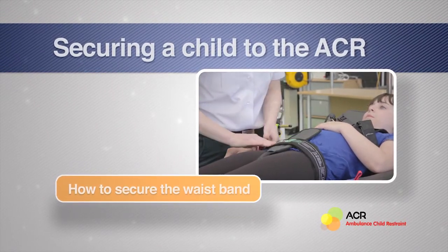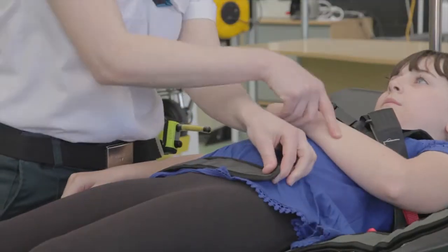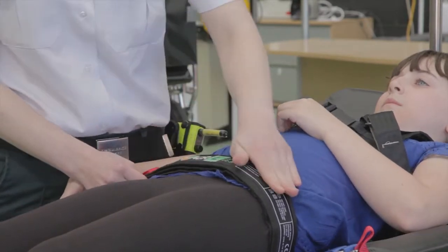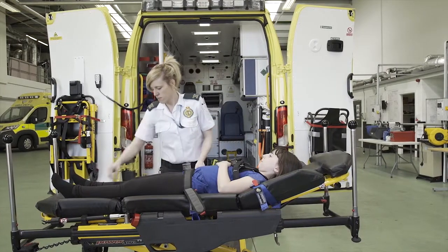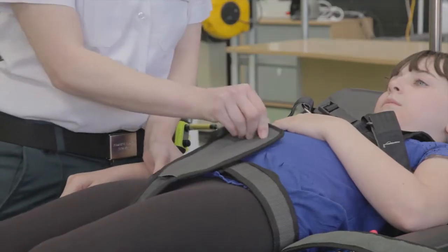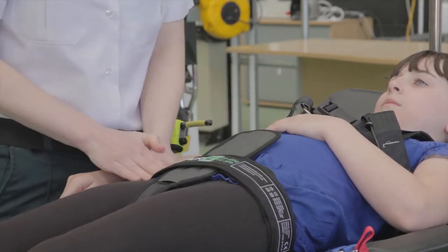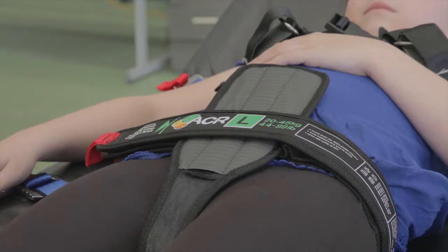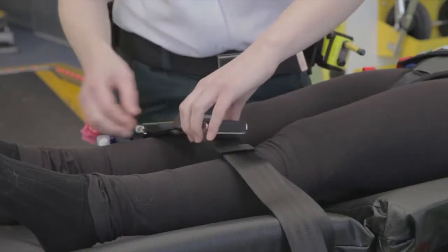Bring the single waist strap across the child's waist. Fit and engage the double waist strap and press firmly together. Lift and peel back the outer waist strap with the red tab. Position the crotch strap centrally, then close and engage the outer waist strap and press firmly together. Ensure the markers have sufficient hook and loop engagement in the contact area. For medium and large harnesses, secure the child's legs with the cot strap.